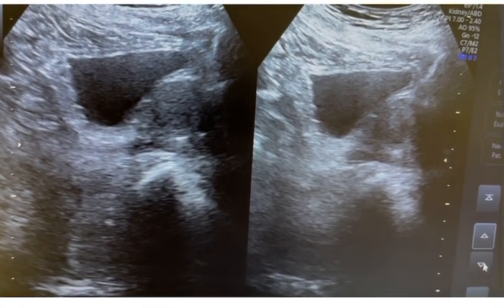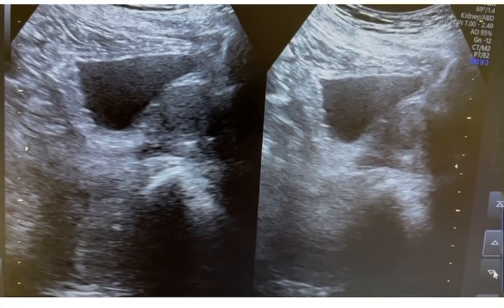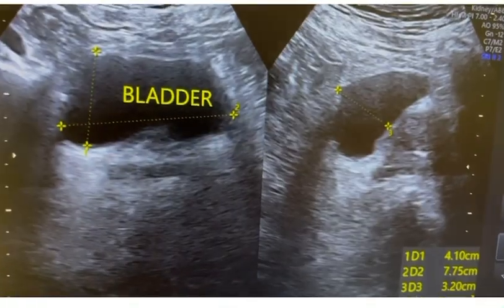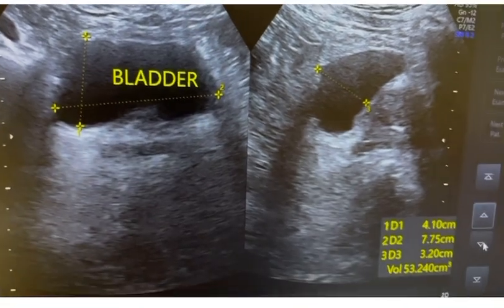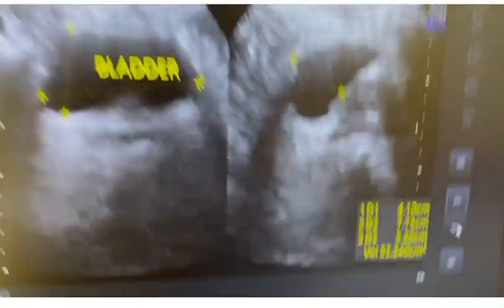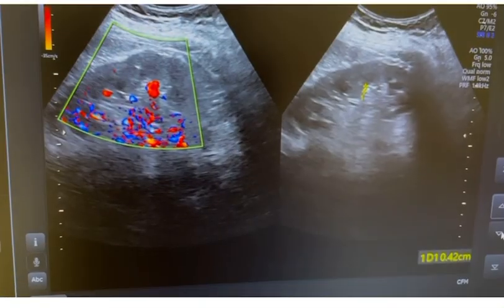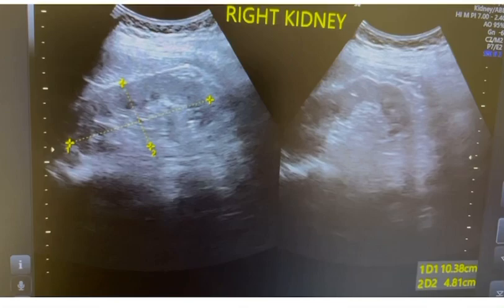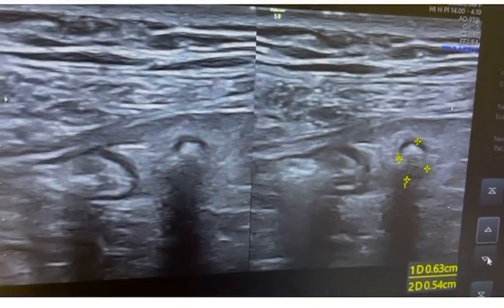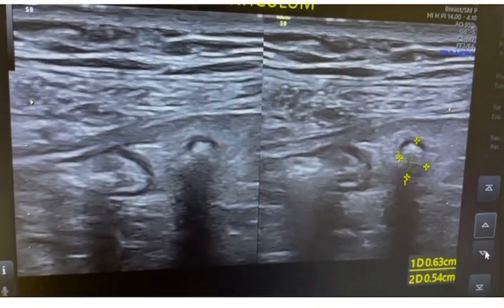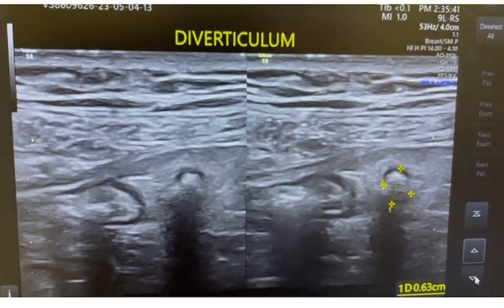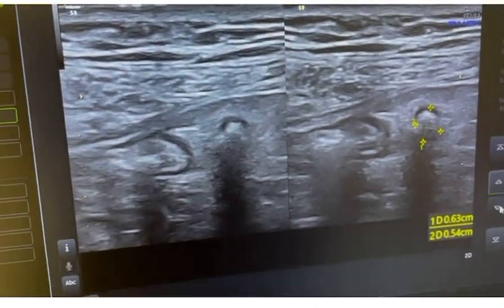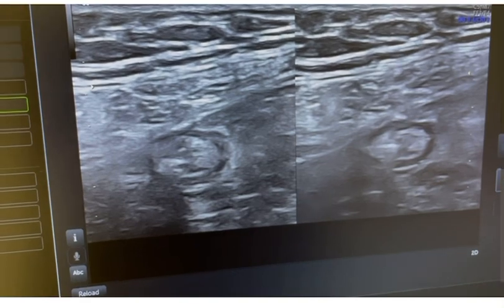This is the longitudinal view of the prostate. This is the bladder with a pre-void volume of 53 cc. We can also see the left kidney and right kidney. There was a diverticulum in the descending colon as well, though that is not the concern of this video.